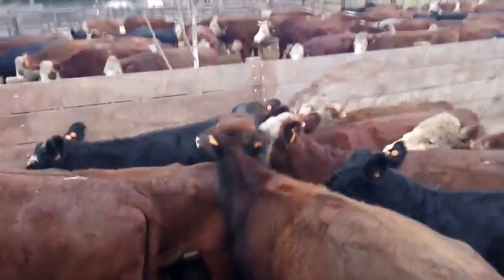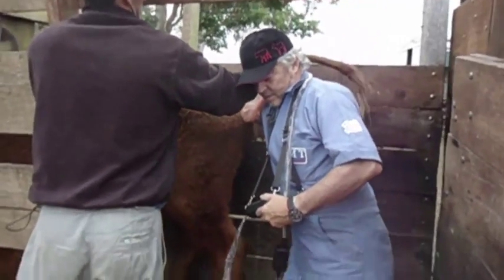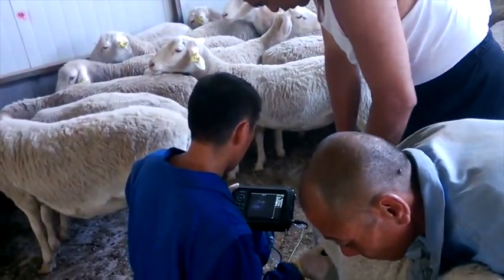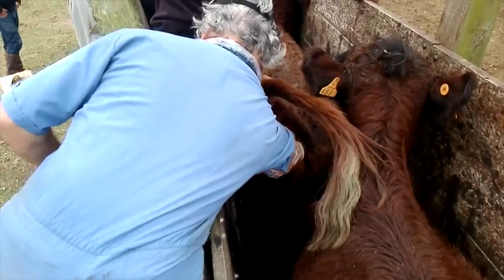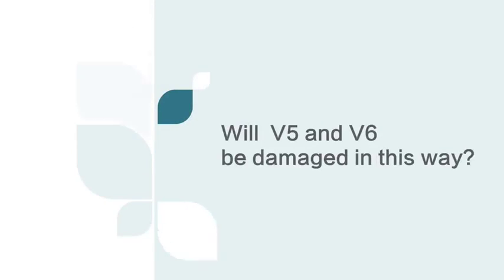Today all kinds of testing equipment are facing various challenges in farms. We have to consider the various possibilities which might happen there. So, if the sow peed on the button when we are checking, if cattle or sheep spit on the screen, will V5 and V6 be damaged in this way? Let's take the following questions to watch this video.